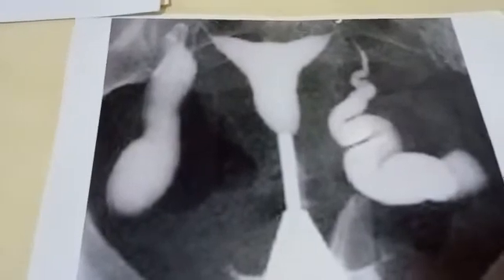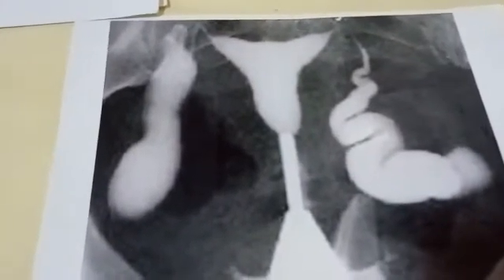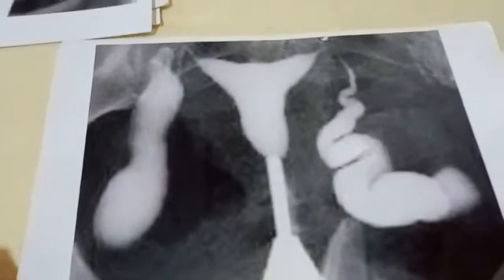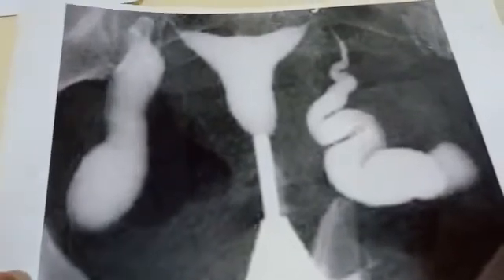Here the cannula is visible during injection on the X-ray film — this is the olive insufflation cannula. This confirms bilateral hydrosalpinx with bilateral distal tubal obstruction, not proximal obstruction.